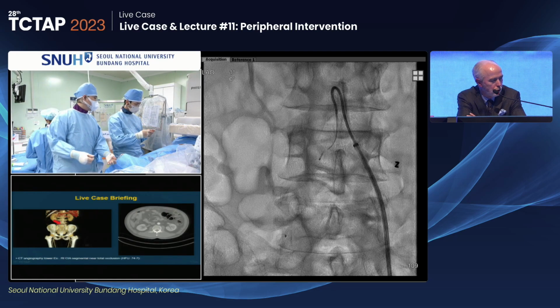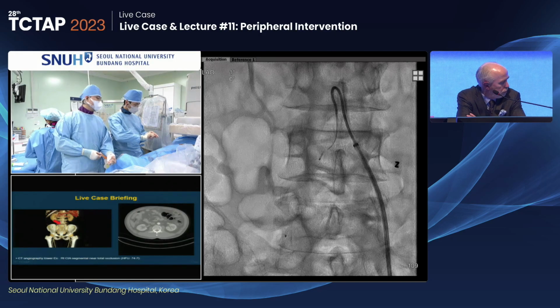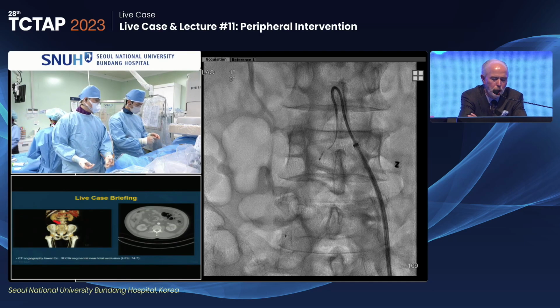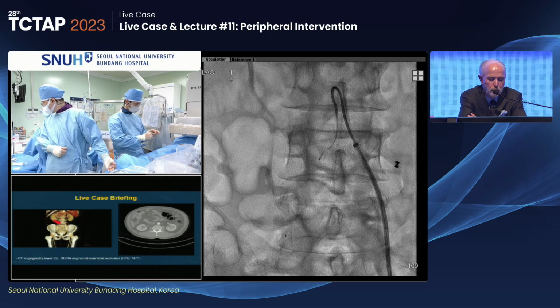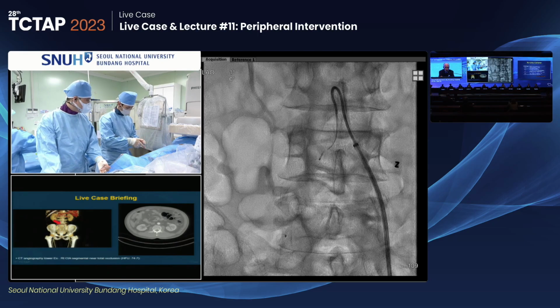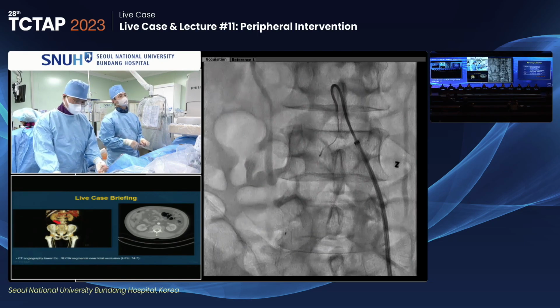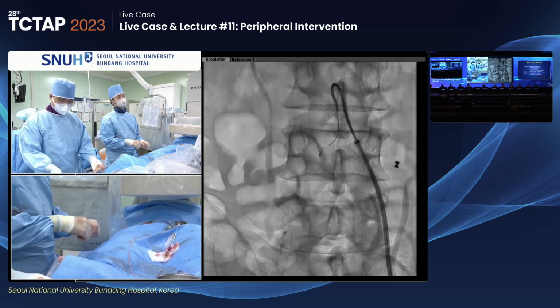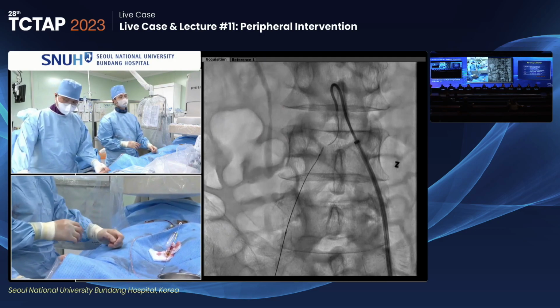So the throw is 11 millimeters on the Outback, right, as is the Pioneer? 12 millimeters, yeah. But yeah, this would be a good case for Pioneer. It's very safe, so it would be an option if you had that available in Korea. Yeah, good idea. But we don't have the Pioneer re-entry devices until now, as far as I know.